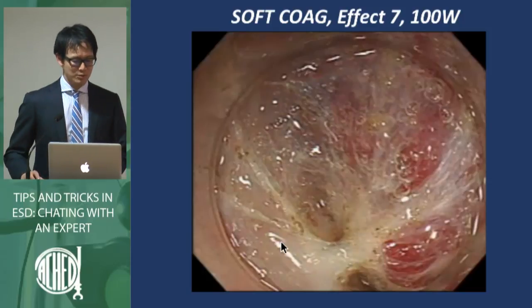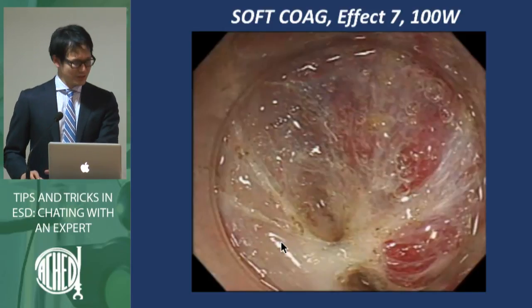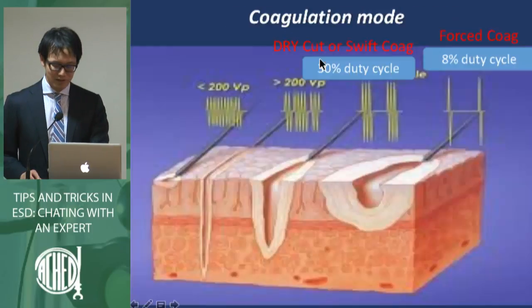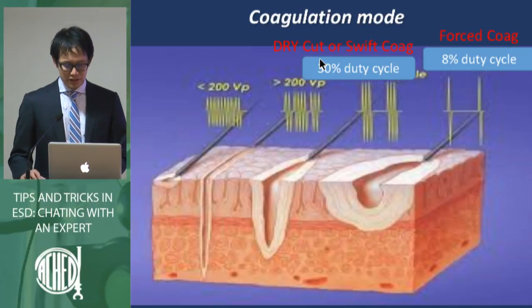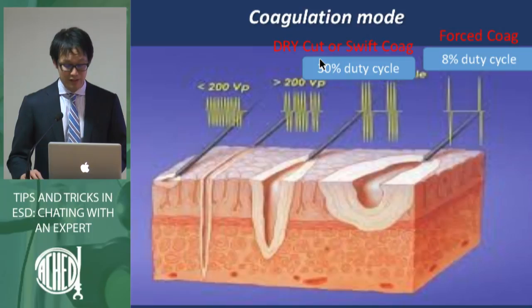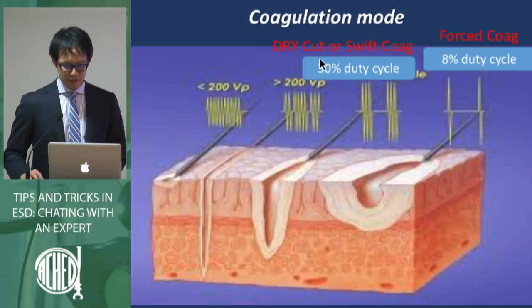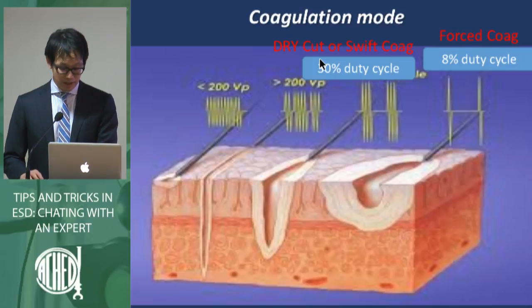Now we are changing soft coagulation to a low voltage setting, so it's a little bit different, but soft coagulation is very useful for preventing bleeding during ESD procedures. Soft coagulation is pure coagulation and doesn't cut the tissue. But when we dissect the submucosal layer, we usually use the coagulation mode, because this mode has coagulation ability together with incision ability. Therefore, we don't worry about bleeding from small vessels while dissecting the submucosal layer. But we must not forget to avoid the penetrating vessels.